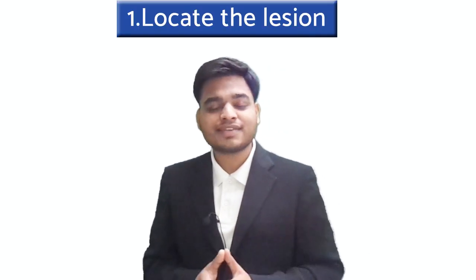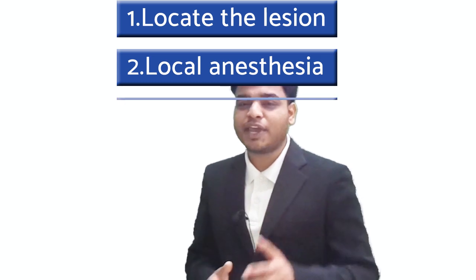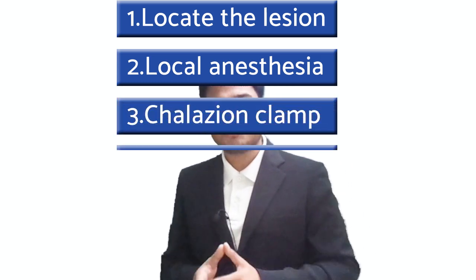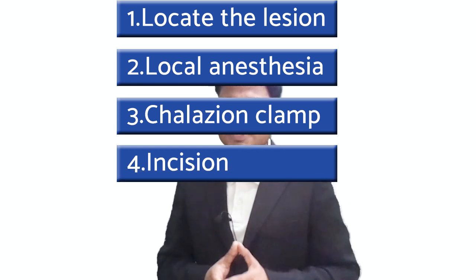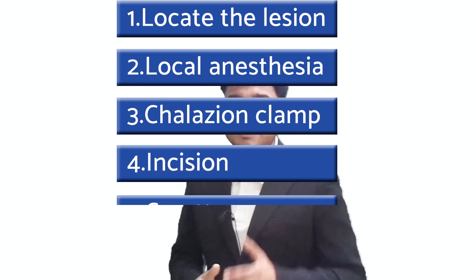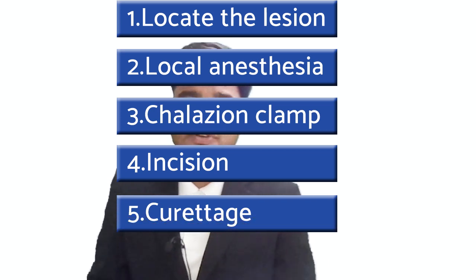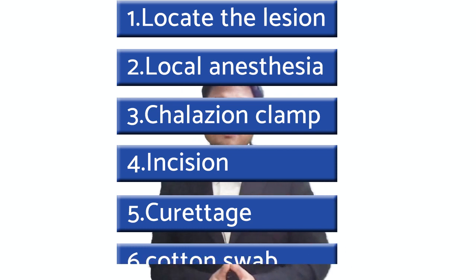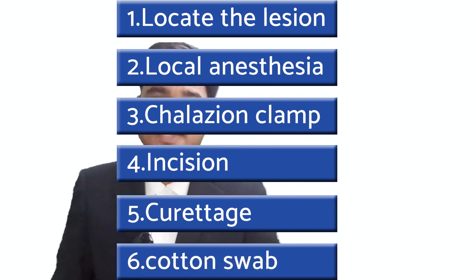Now let's wrap up with a quick summary. Step one: mark the lesion with a marking pen. Step two: apply local anesthesia. Step three: apply the chalazion clamp. Step four: make the incision with a Bard-Parker size 15 surgical blade. Step five: curettage using the chalazion scoop. Step six: apply a cotton swab and achieve hemostasis.